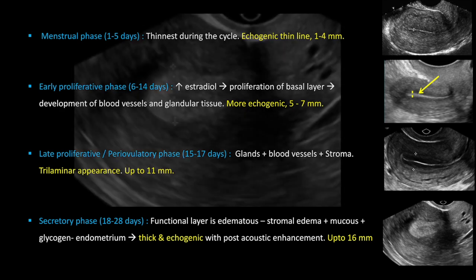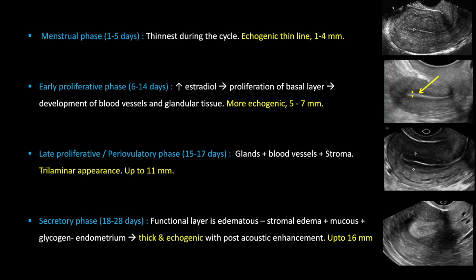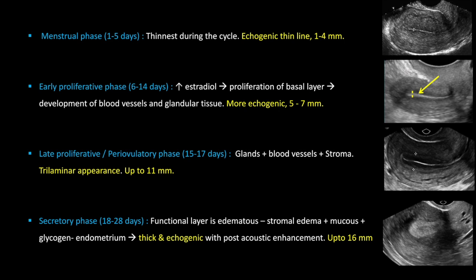The secretory phase lasts from day eighteen to twenty-eight in a normal cycle. During this phase the functional layer is most edematous, with stromal edema, mucus, and glycogen. Because of this the endometrium appears thick and echogenic with posterior acoustic enhancement, and the thickness can go up to sixteen millimeters.